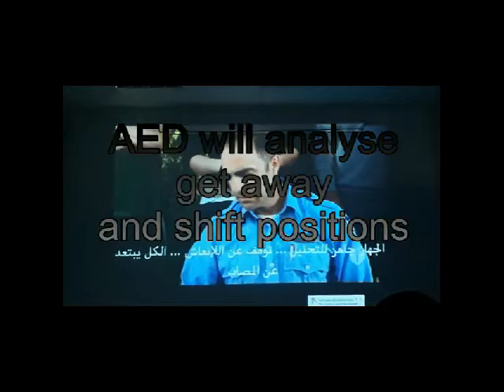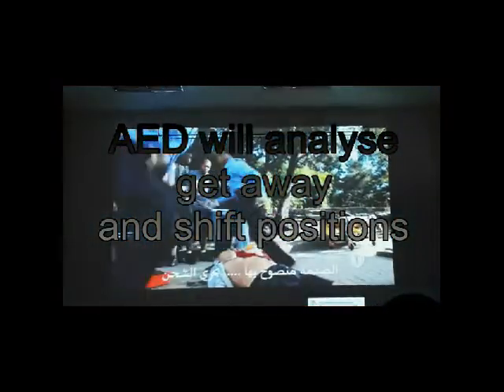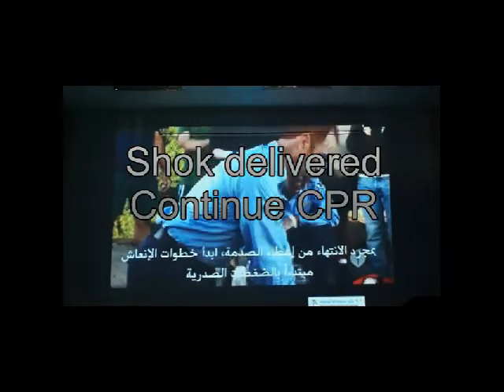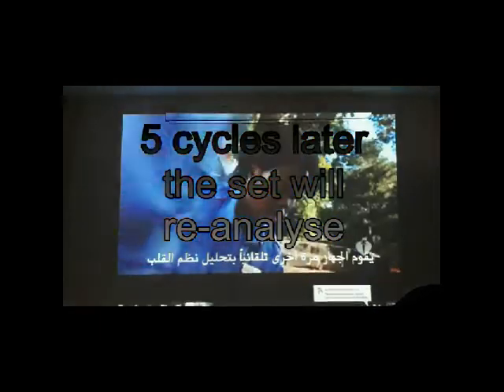Do not touch the patient. Let's switch now. Shock needed. Charging. Press the flashing shock button. Everybody clear? Pushing button now. Shock delivered. Begin compressions.